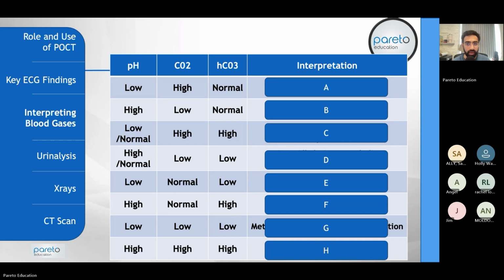So if the pH is low and the CO2 is high and the bicarbonate is normal, how would we interpret this? Yes, respiratory acidosis indeed.